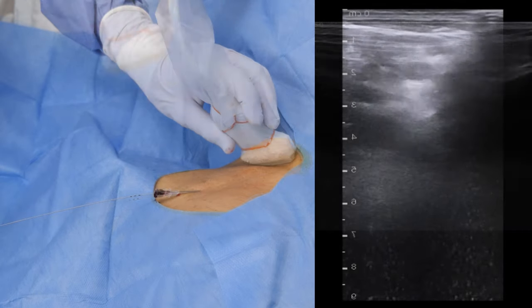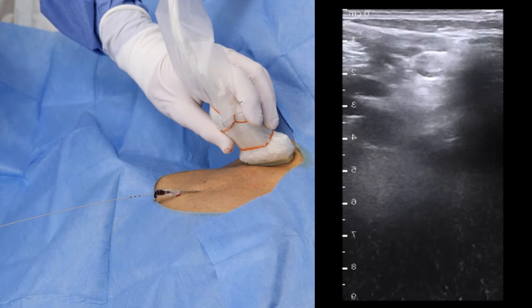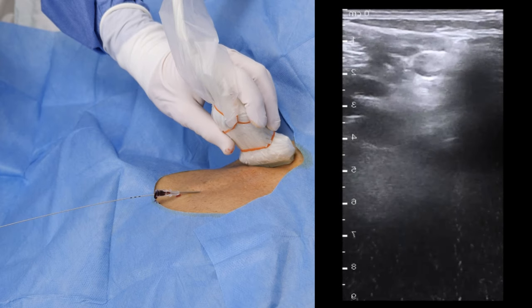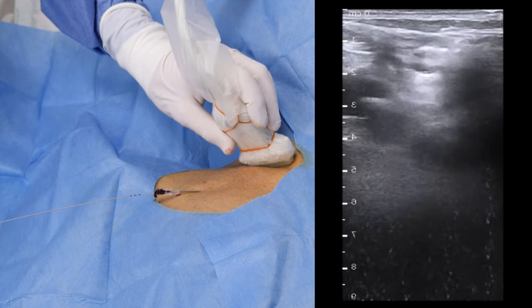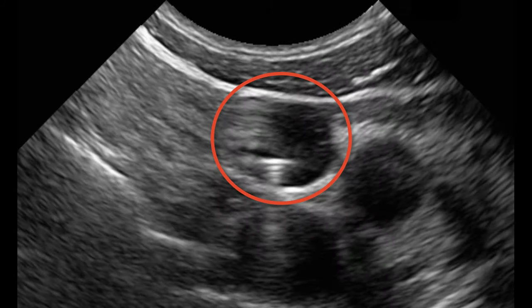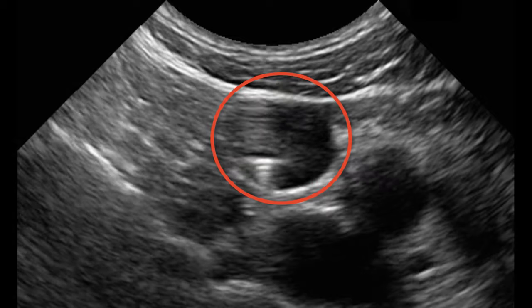Next, move the probe to the neck. If the guide wire has deviated cranially, this will be seen as a hyperechoic dot in the internal jugular vein. This is readily apparent in this sequence from another patient, where we were able to immediately retract and reposition the guide wire.